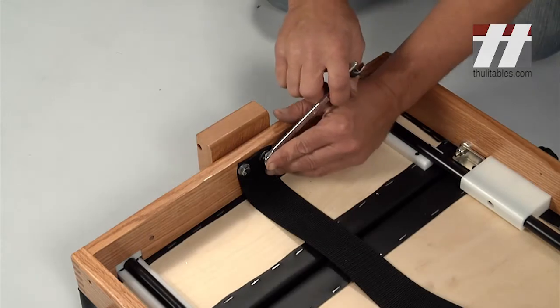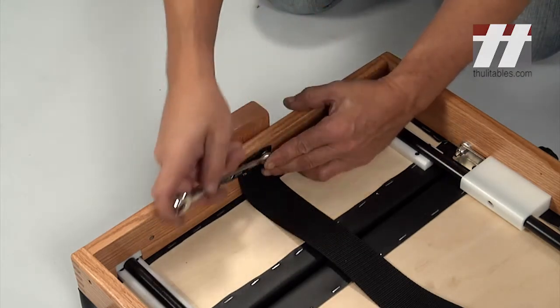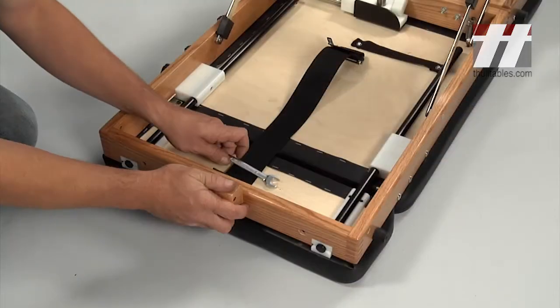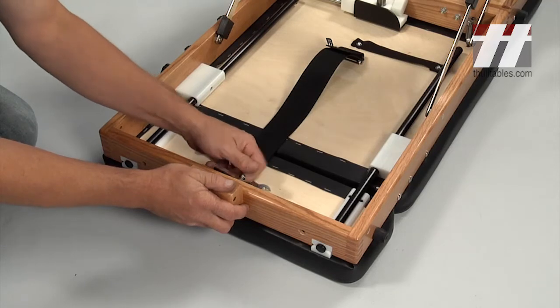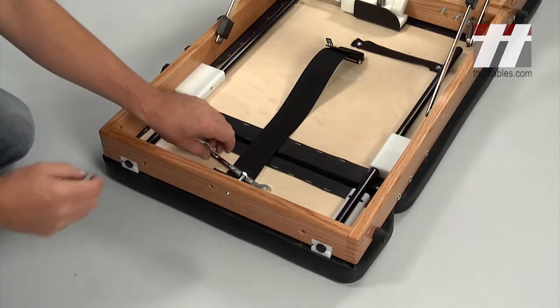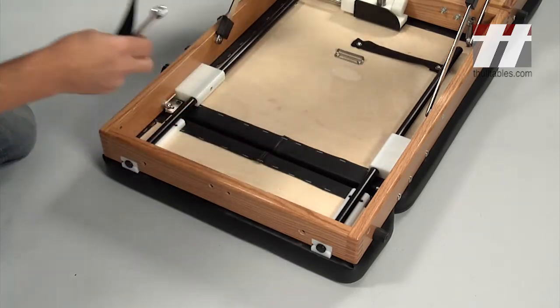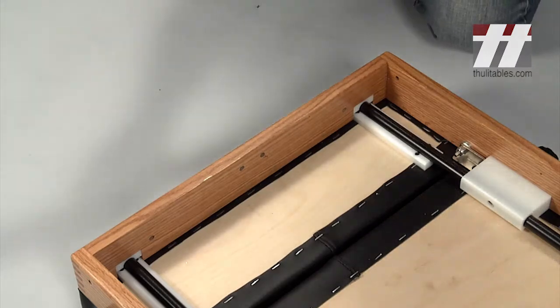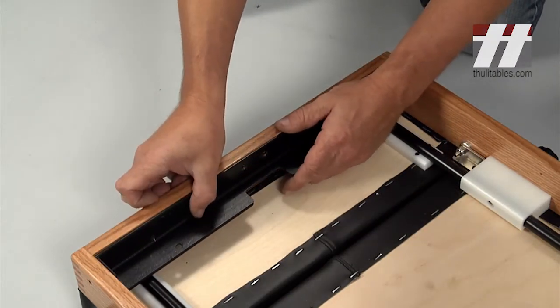Remove the two bolts that secure the headpiece strap and closing block to the table. Discard the strap, bolts, and washers. Next, attach the mounting angle to the table and reattach the closing block using the pre-waxed screws provided.